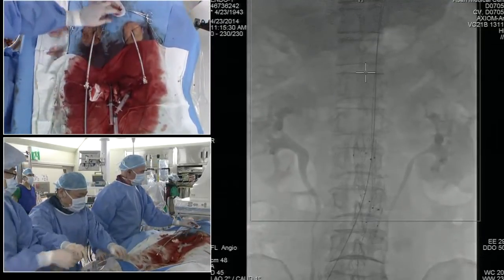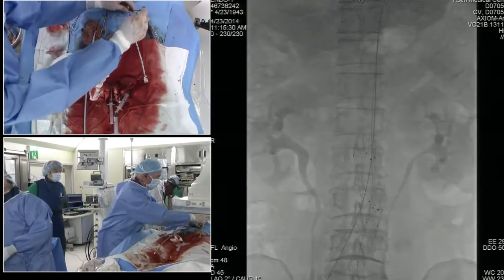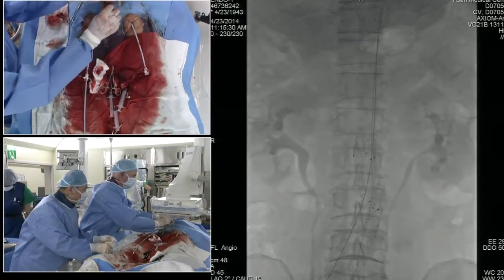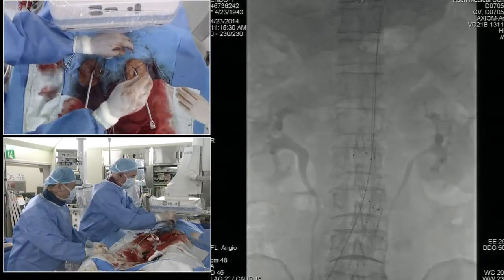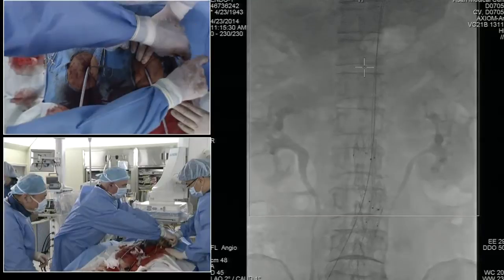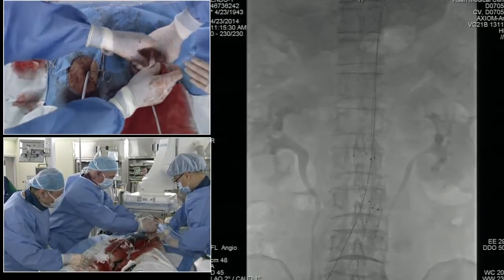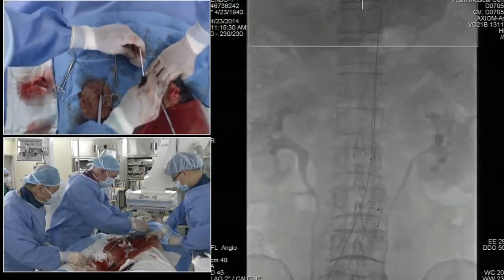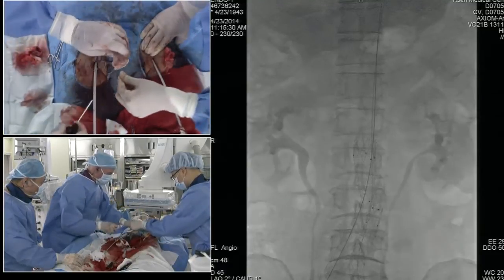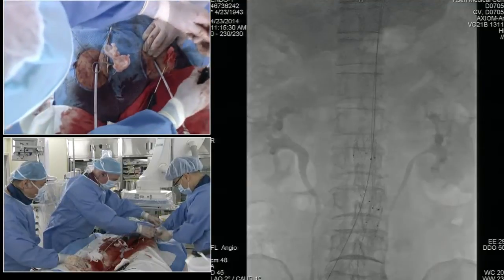Can we show the groins? Are we able to see them pretty well here? Yeah, we can see it. So here's the second. This was number two in terms of the ones. The medial one was the second pre-close deployed. And then the lateral one is the first. So Dr. Park is going to help out by holding groin. Before we do anything, I'm just going to wet these sutures and make sure the knots slide down. And we'll take the knot pushers and get them ready to go. So we just got everything kind of in place.